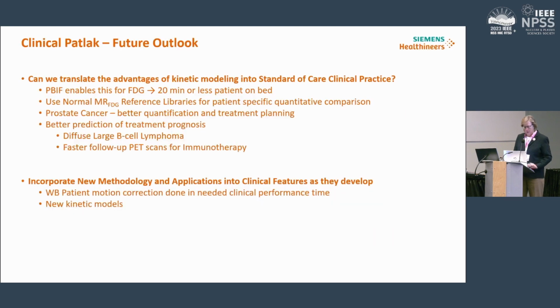So the future outlook: I think we've got to translate what we have been finding into our products. And I list out what I've already talked about. We definitely need to get that patient motion correction in there as best we can. Certainly we at Siemens, and I'm sure other vendors, are also actively working on this point, and also developing new kinetic models.